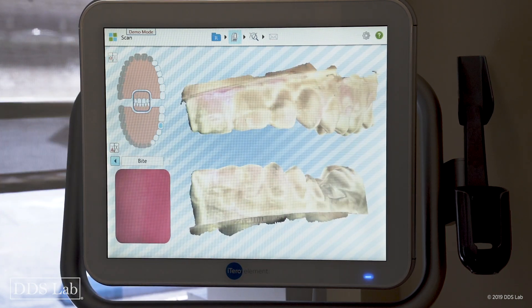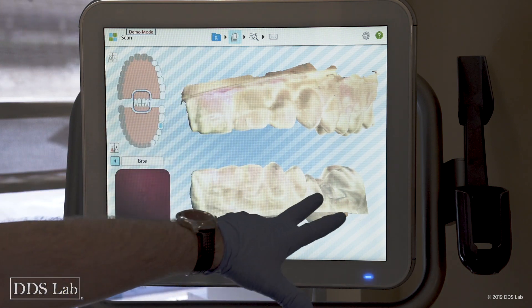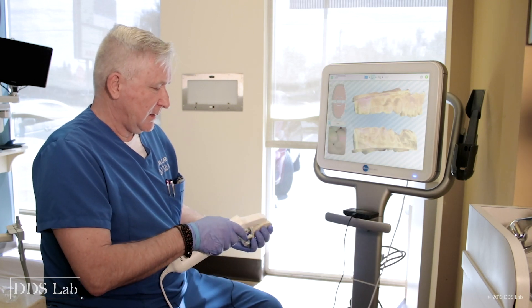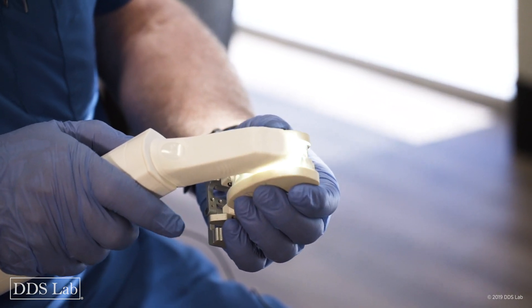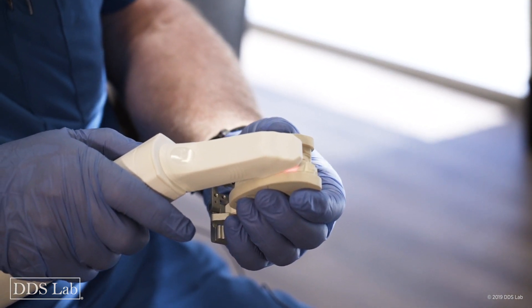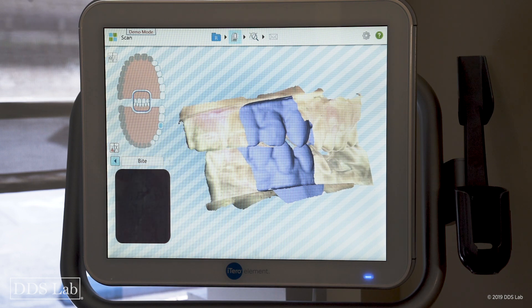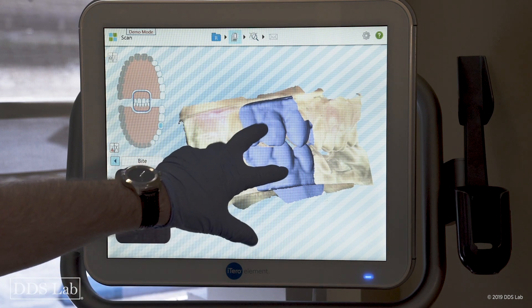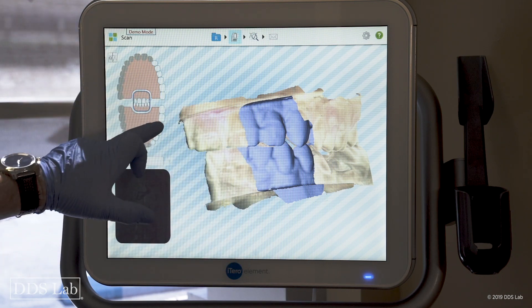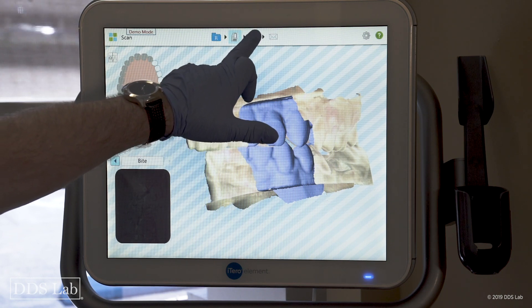The last section to cover is the bite. I have my upper, my lower, and my prep — now I do the bite. I position my camera making sure I get the gingiva from the upper and the lower, roll a little bit if needed, and after two to three seconds I stop. It turns purple and the bite is done. I now have upper, lower, crown prep, and bite.